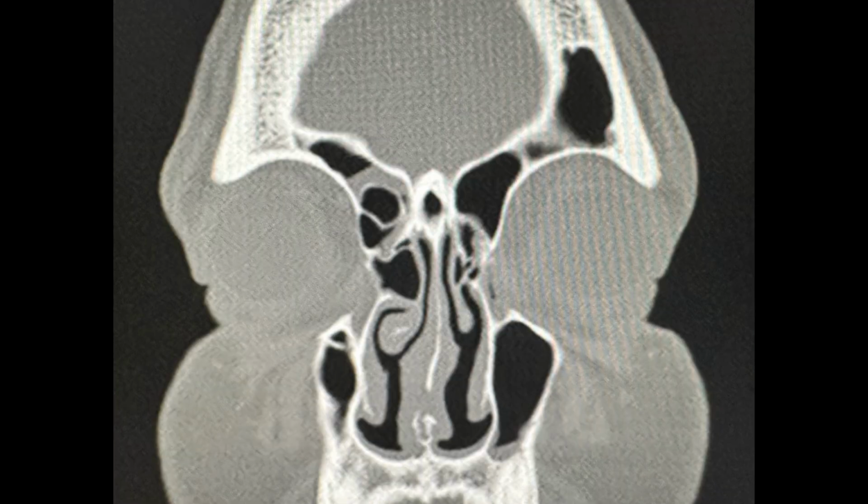As we see here, the number of cells increase, and now we come into a T3 sort of configuration where there is the agger and there are two cells above the agger, one above the other, around which the frontal sinus eventually and the frontal recess drains above these cells.